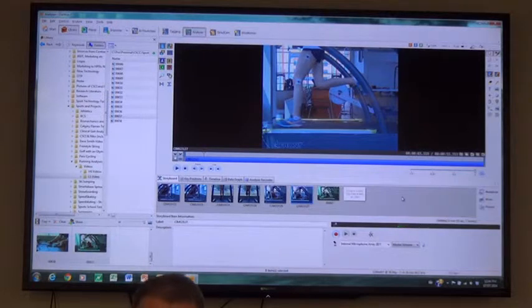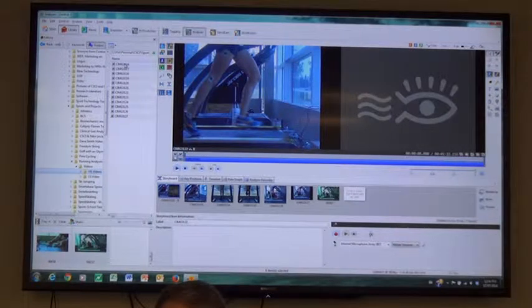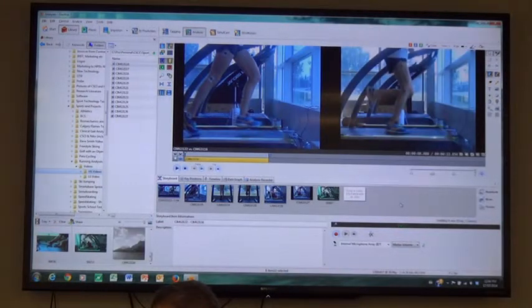This first video is at 8 miles per hour, without her orthotics. Now, if I was to pull in the video and do a side-by-side comparison, first of all, this video is the first one that we collected, without her orthotics.